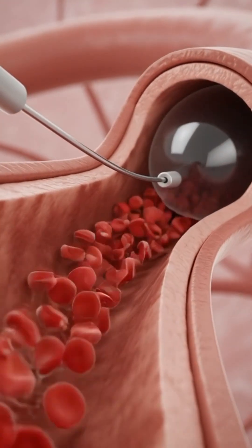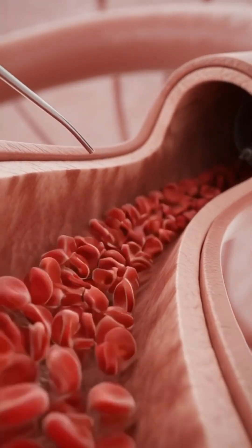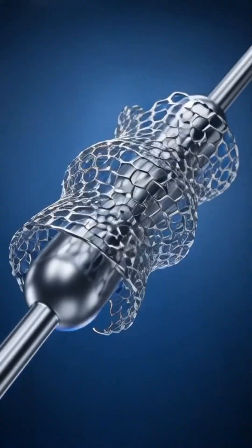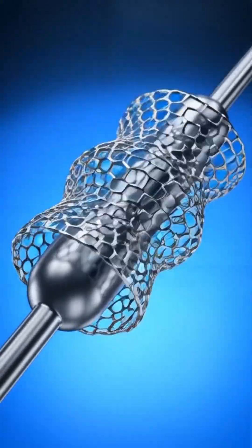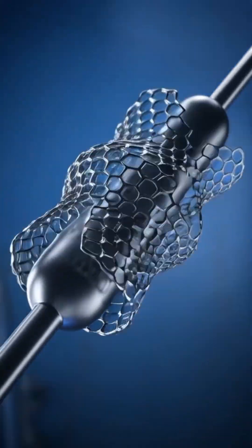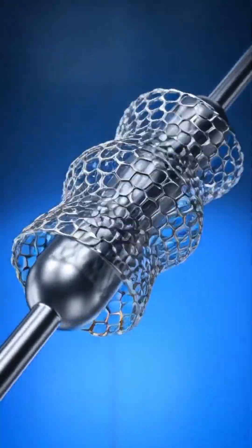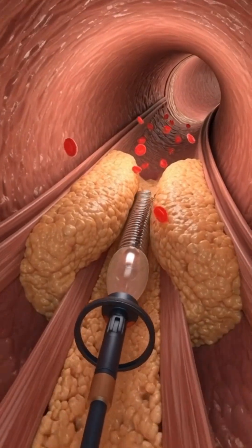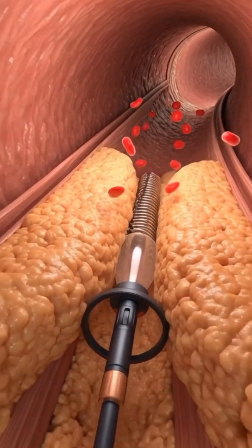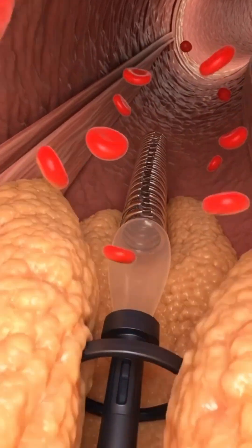The artery stays wider and blood flow improves. A stent is a small metallic mesh tube mounted on a balloon catheter. The stent is placed at the blocked area, just like angioplasty.